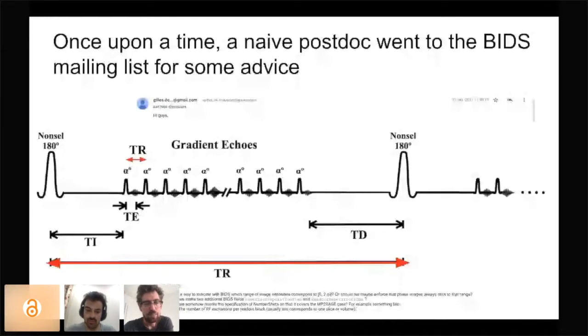One of the interesting things is that some parameter names that are very common in functional MRI, something like repetition time, it turns out when you go to the field of qMRI and the MR physics get a bit more complex, and also the diversity of sequences becomes more complex, these concepts that we think we know well turn out to have different meanings.